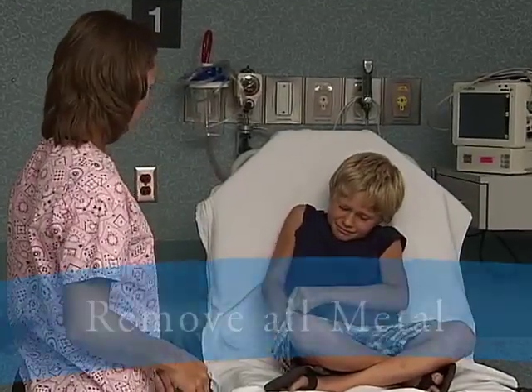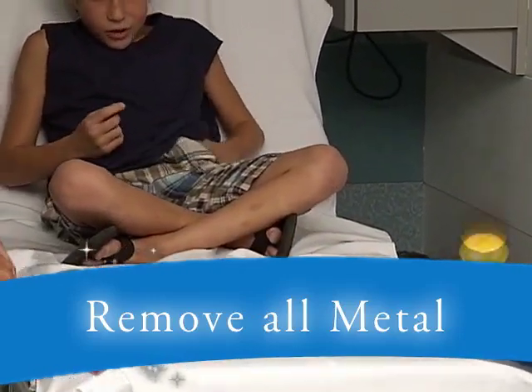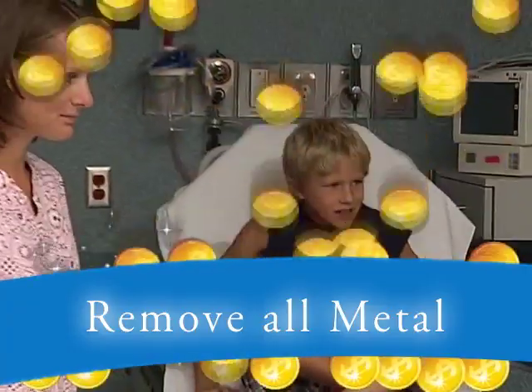First, you'll need to make sure you don't have any metal in your pockets or on your clothing, so you'll have to remove any coins or belt buckles that may interfere with the MRI.